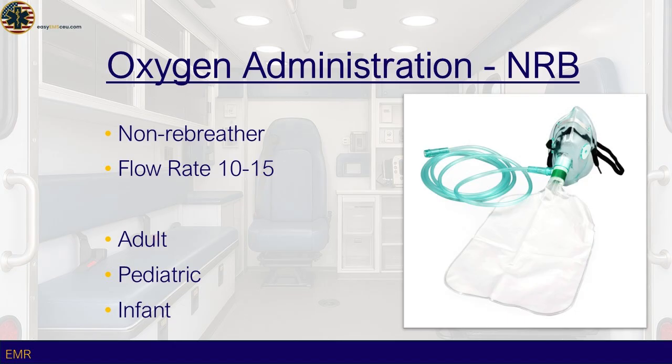While the risk is generally lower in acute pre-hospital care, EMS providers should always reassess the patient's condition and adjust oxygen therapy accordingly. Proper application of an NRB involves securing the mask snugly over the patient's nose and mouth, ensuring an effective seal without causing discomfort.